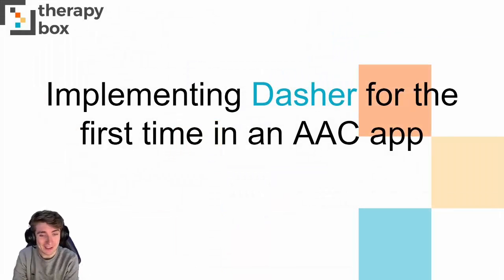Hi there, thank you for choosing to listen to my presentation about Dasher and how we've implemented it for the first time in an AAC app. My name's Brad Jordan. I joined the TherapyBox team this year after finishing my studies in computer science, and as a quick introduction to Dasher, it's an innovative text entry method whereby you can use one continuous flowing gesture to write your text. That probably doesn't make sense right now, but I promise it will soon.